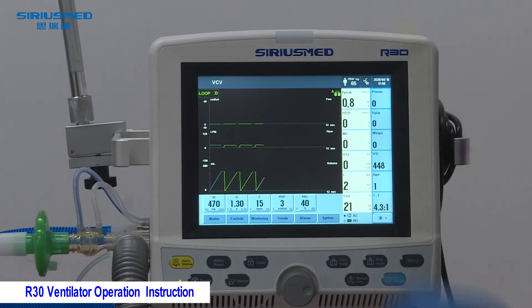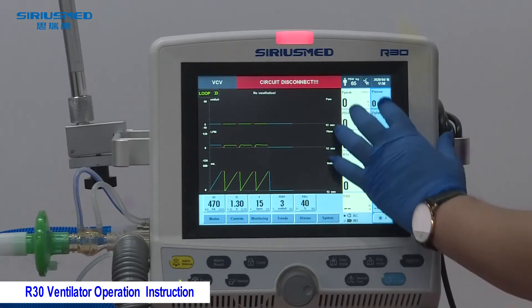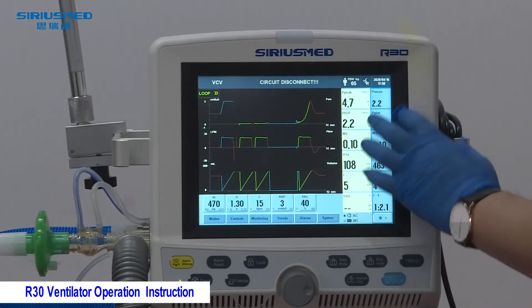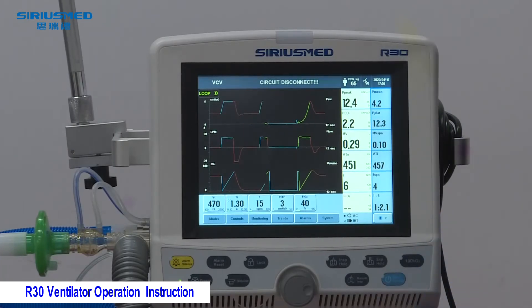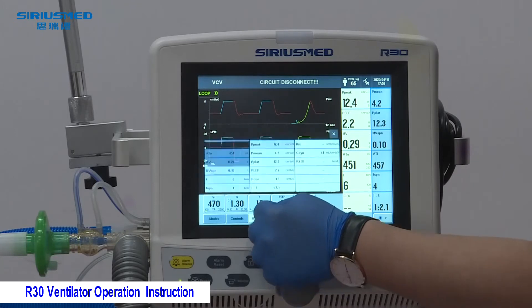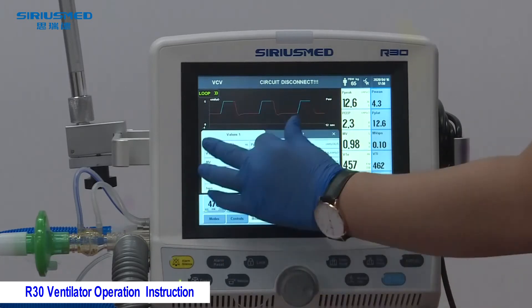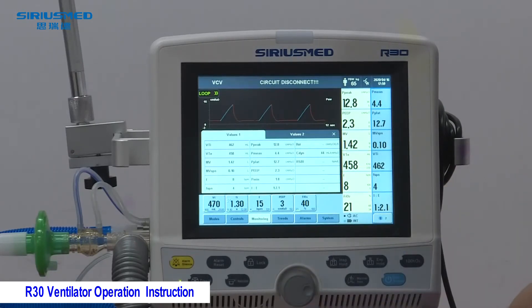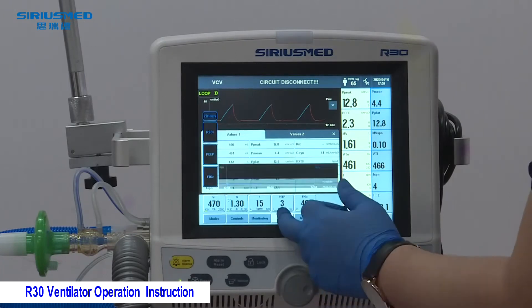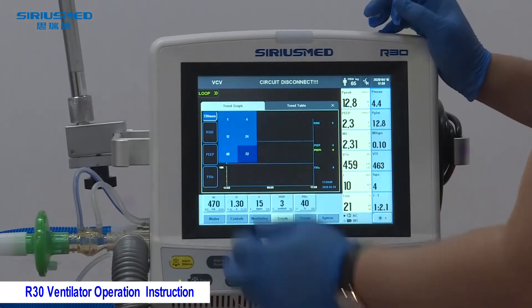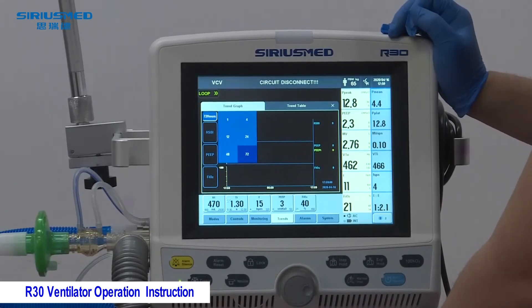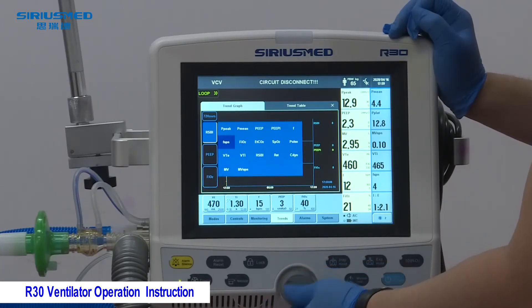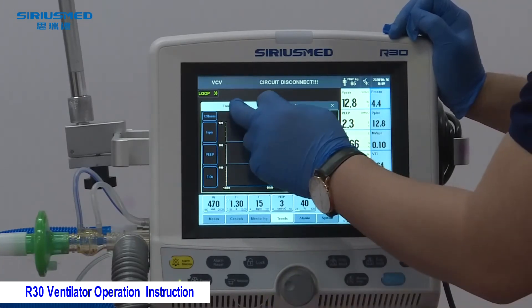Now we can see this section: this is the monitoring parameters display. If the doctor wants to see the full monitoring parameter information, they can access the monitoring menu for a complete parameter overview. In the 'Changes' section, there is up to 72 hours of trend information. The doctor can navigate the parameters using the knobs, and there is both a trend graph and a change table available.